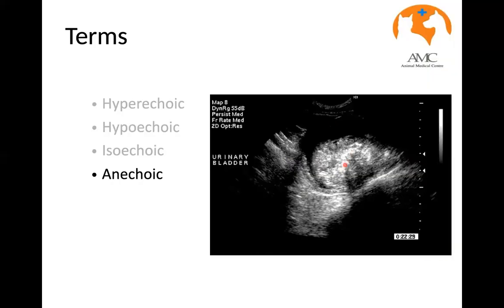And this area is hyperechoic as compared to this area, right? Because you cannot say hyperechoic without comparison. We just need to understand that we need to compare. Anechoic, you can say if it's completely black, you don't need to compare black with white. Complete black means complete black. So we can say anechoic, but for isoechoic, hypoechoic, and hyperechoic, we have to compare. This area is hyperechoic as compared to this area. This area is hypoechoic as compared to this area. And if the two areas have the same brightness, then we can say isoechoic.